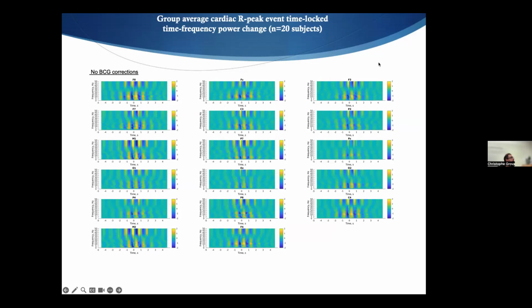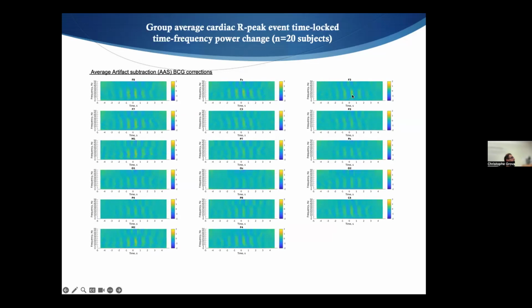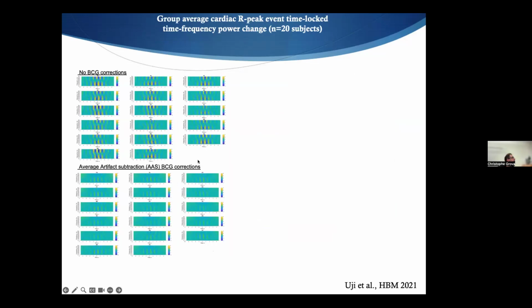It's a strong oscillation that you see. Some of the peaks should be around here, around 400 milliseconds, but that's what you see. This is what you see when you subtract using the subtraction method. The artifact is still there, but in terms of intensity, it has been greatly removed. So this is where we are.